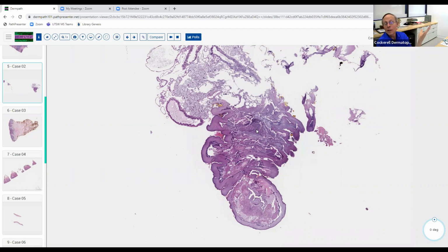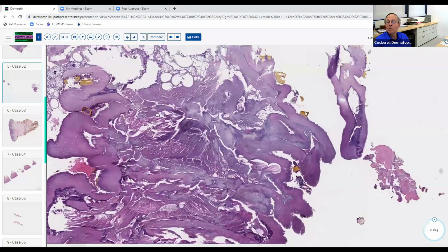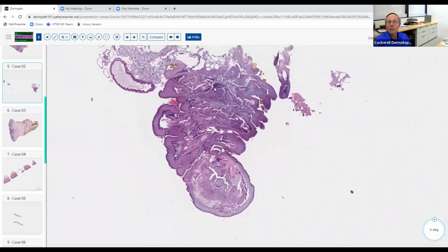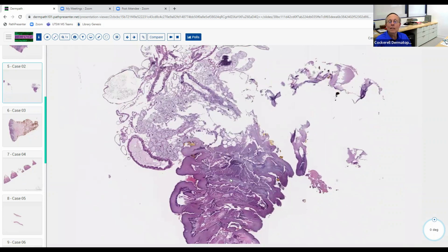The more common ones affect cattle and other animals out on the savannah, and man is just an accidental host. But there is one fly that actually likes humans the best. They have these little dark bands, these black little rings, and under the microscope they have these yellowish-brown chitinous excrescences, which correlates with Dermatobia hominis. So this is absolutely an example of myiasis, however you want to pronounce it.